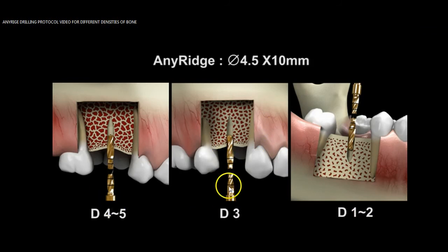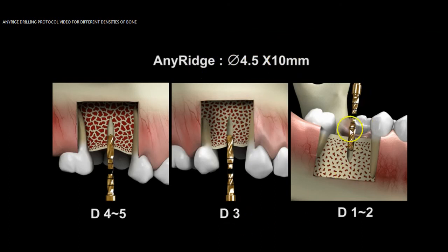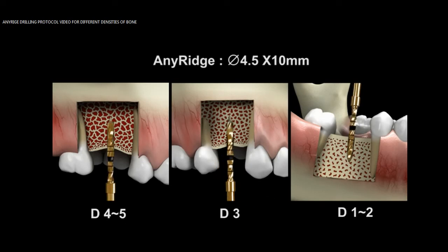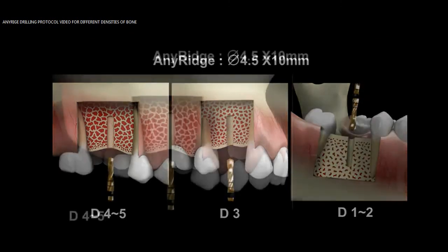The next drill that you see — and by the way, it's showing the drilling protocol for a 4.5 by 10 AnyRidge implant — is a 2.0 twist drill. The markings on here are 7, 8.5, 10, 11.5, 13, and 15. So, your 10 millimeter mark is right there. That's your second drill.